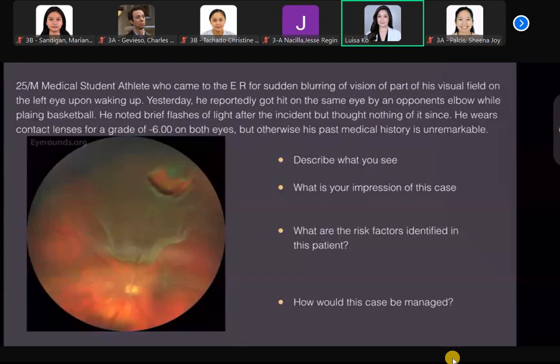Because of those attachments, especially if your tear is along the ora serrata, your vitreous will continue to pull on your retina, so it exacerbates the tear and the retinal detachment. So before you can flatten it out, you want to make sure that you clean out the vitreous. Even if there's nothing wrong inherently with the vitreous and it's the retina that's the problem, you want to separate it, because otherwise the vitreous is just going to keep tugging on the retina. So remove the vitreous so that you can flatten it. Understand? Can you imagine the concept?